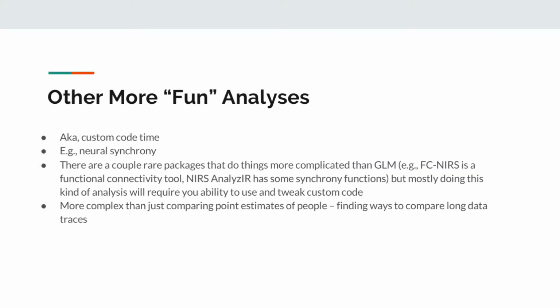But besides general linear modeling, there are some other more fun analyses you can do. And at this point, you pretty much are going to be depending on some custom code. There are a couple packages out there that are available publicly that do things more complicated than general linear modeling. For instance, there's an fNIRS tool that does a functional connectivity thing, and it's just a specific library instead of a fully completed analysis software.